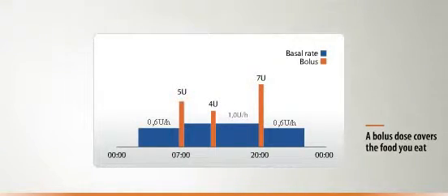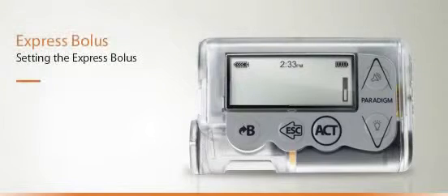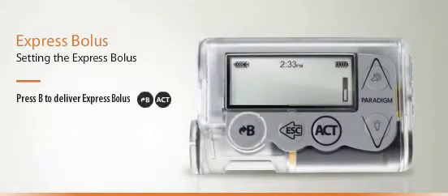Bolus insulin covers your mealtime insulin needs and can also help you to lower elevated blood glucose. Your healthcare provider will help you to determine what your basal and bolus rates should be. The express bolus function on the Paradigm Veo allows you to administer bolus insulin by pressing the B button.